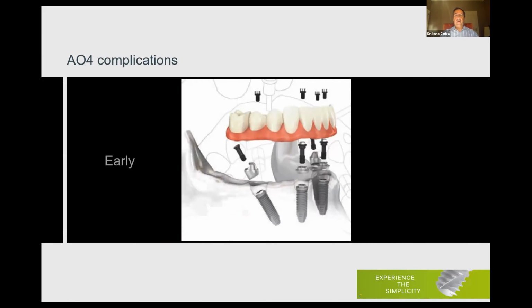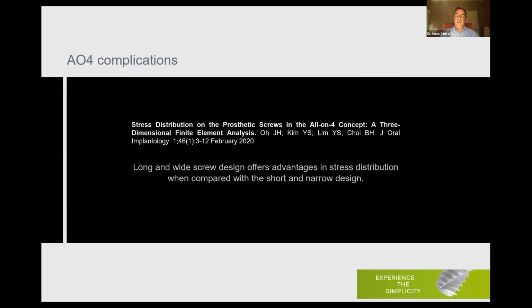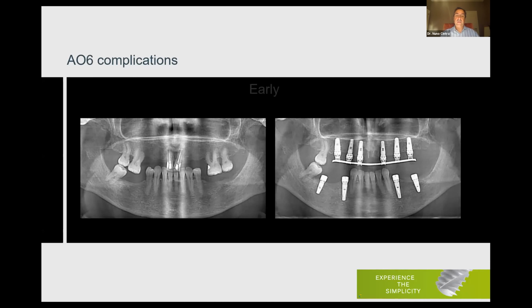Complications, well, complications can start even before surgery, of course, as we spoke before, regarding the smile and the lip support. But of course, when we are dealing with so many screws, we can have complications with the screws. For instance, this is a very recent article. They compare long and wide screws with narrow and short, and of course, long and wide screws gave us an advantage in stress distribution in this kind of situation.